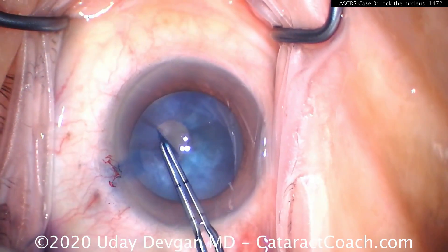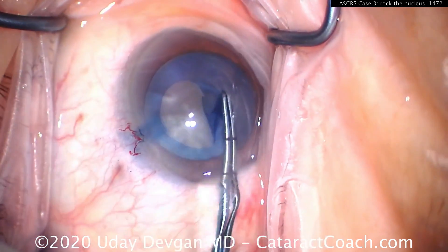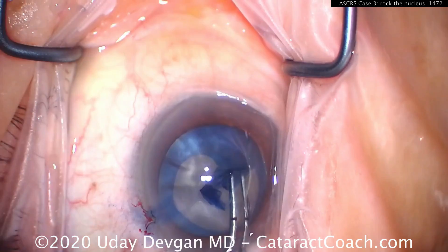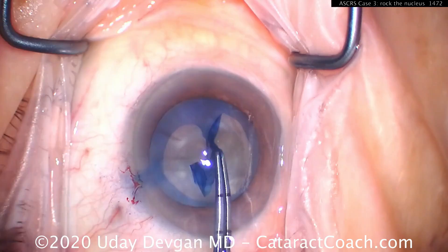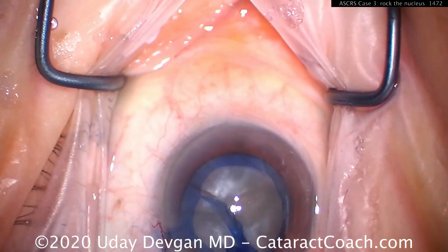Here's an intumescent white cataract, not as pressurized. Getting the capsulorhexis done, and it wants to run out. We have to resort to a little maneuver here — pulling backwards on the rhexis to help control it — and even there it wants to run out.